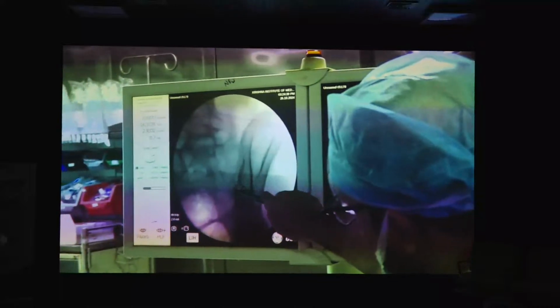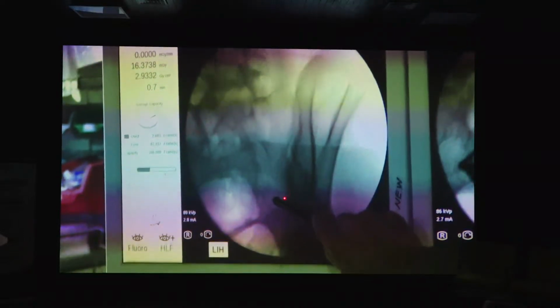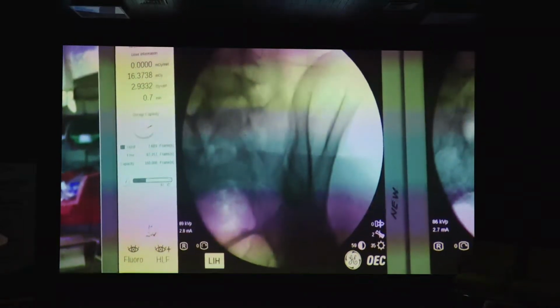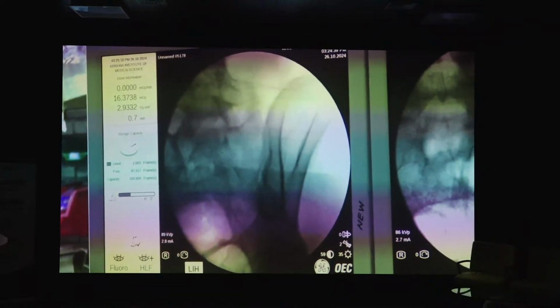As Laukumar is showing, that is the lateral margin of the SI joint, and the medial margin is medial to that line, and the lower one third is the opacity. That is where you can see the darkening of the joint. The upper two thirds is most of the time unified with the bony unification. So we have to enter into the SI joint from the lower one third.